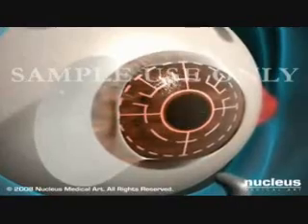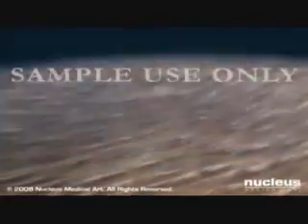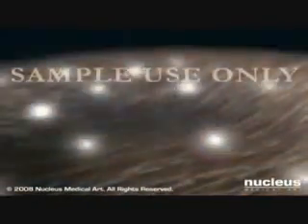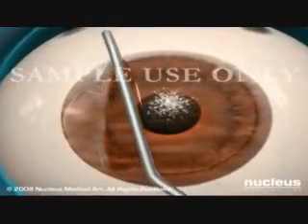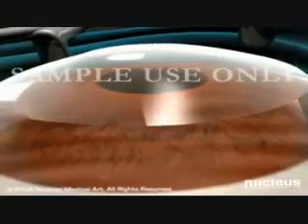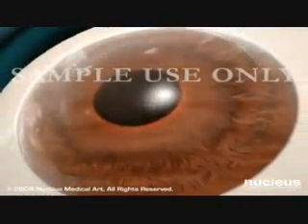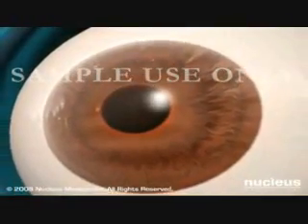After removing the suction ring and microkeratome, your doctor will use pulses from a computer-controlled excimer laser to reshape your cornea by vaporizing tiny portions of its interior. This part of the procedure usually takes less than 60 seconds. Your doctor will then replace the corneal flap into its original position and observe the eye for several minutes to ensure bonding. Because the cornea bonds so quickly, healing is rapid and the eye does not require stitches.